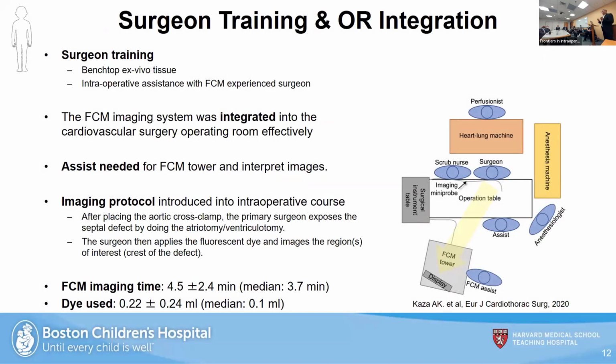Coming to surgeon training and OR integration, as we moved to the larger trial, we recruited more of the surgeons. In the Optima trial, we have eight surgeons trained for using the FCM system in the OR. These surgeons were given a benchtop ex vivo setup for learning how to use the FCM system using the probe. In addition, intraoperative assistance was provided by an experienced surgeon, Dr. Kaza, who has the most experience with this.